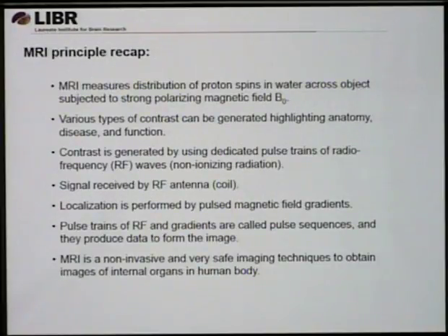You don't even know it, sitting in the audience, but there are broadcasting stations everywhere. If you had magic glasses to see RF waves, the whole room would be full of them. So that's exactly what we use in fMRI. A little bit stronger waves, but essentially this is what it is.